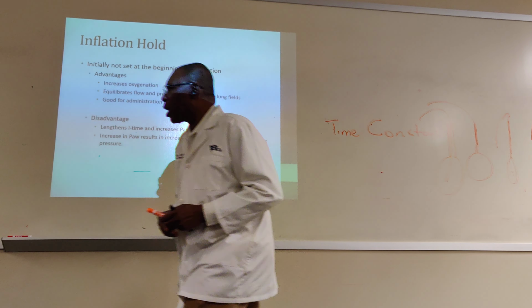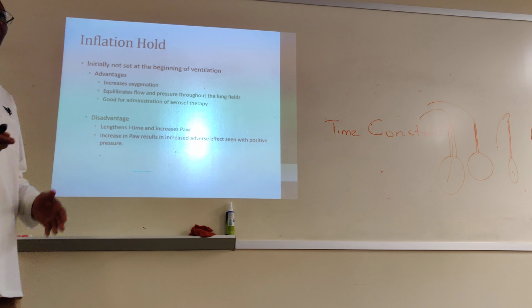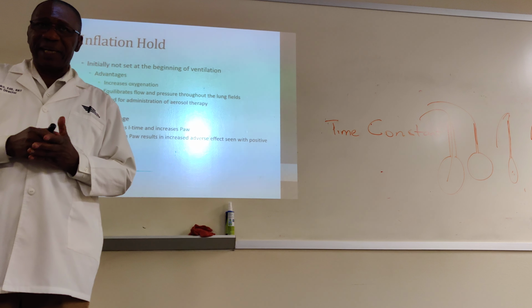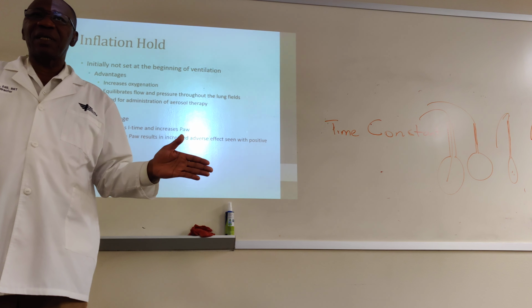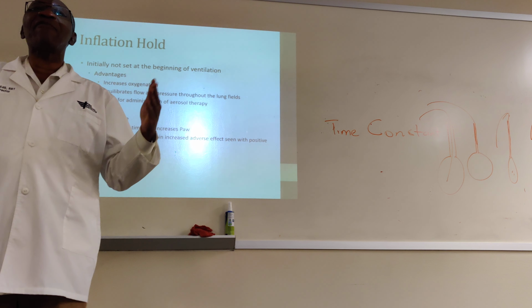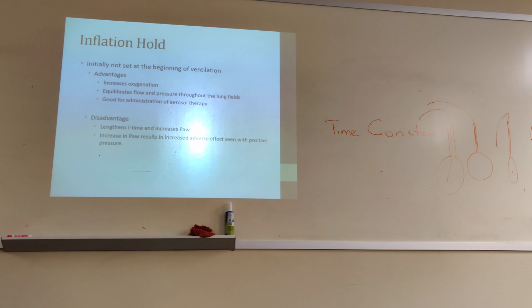Now remember, what actually increases oxygenation is how many alveoli you have open, not necessarily the extent to which you distend them. Lung recruitment means opening up more alveoli. That's what lung recruitment means. It's also good for administration of aerosol therapy.